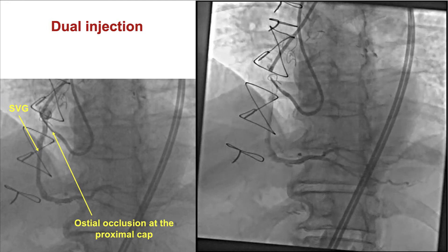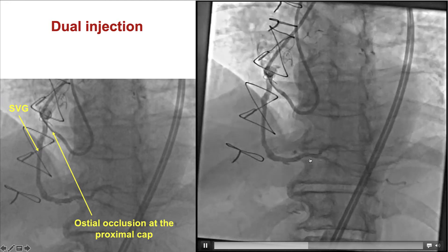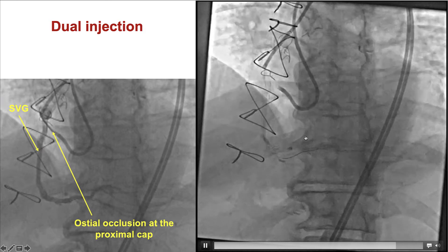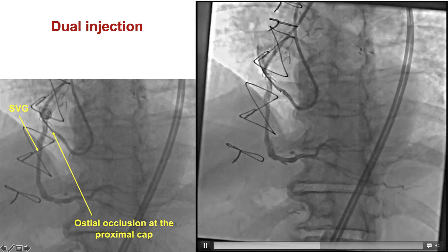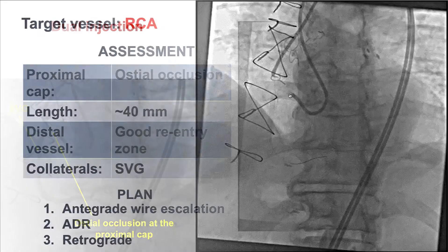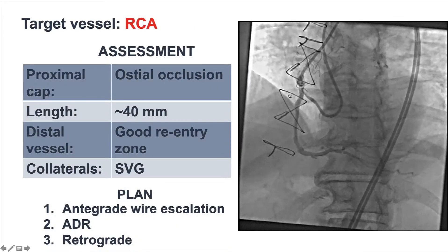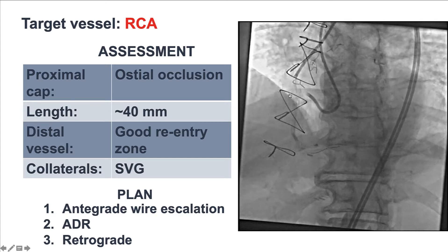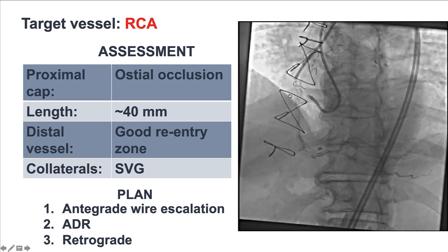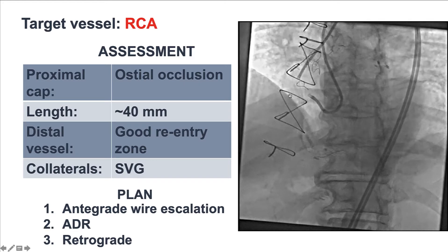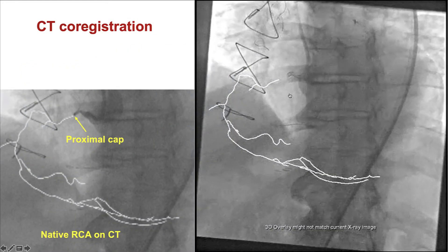These are the angiographic images. The vein graft had restored flow after successful recanalization. The right coronary artery was occluded in its proximal segment. We have occlusion of the proximal RCA, length about 40 millimeters, a decent re-entry zone, and there is the vein graft available for the retrograde approach.